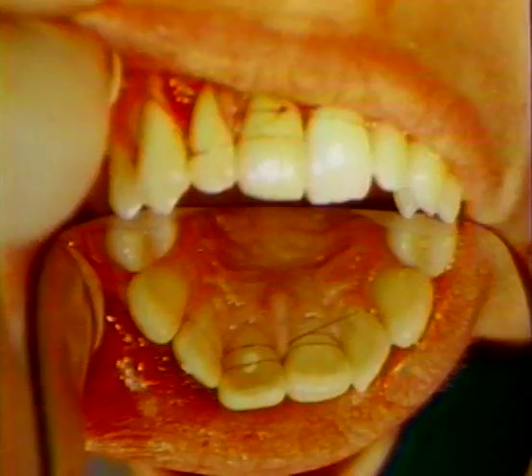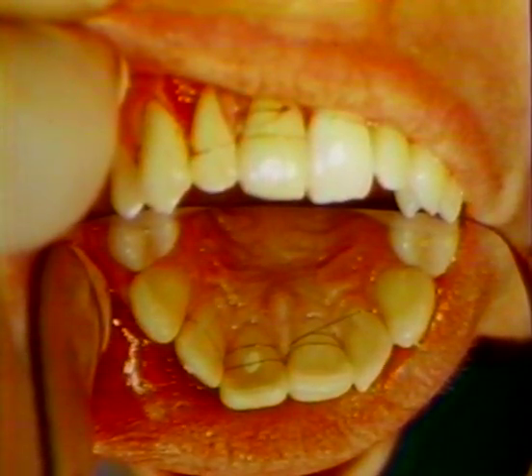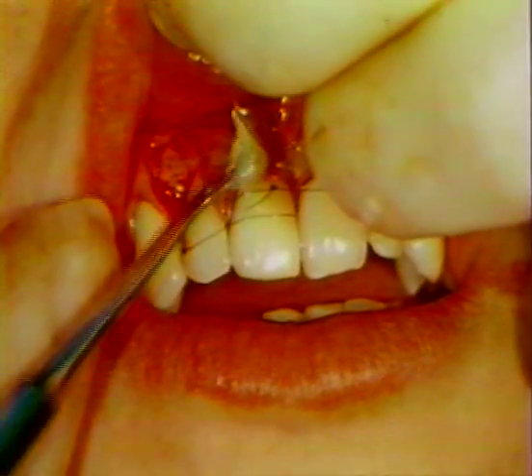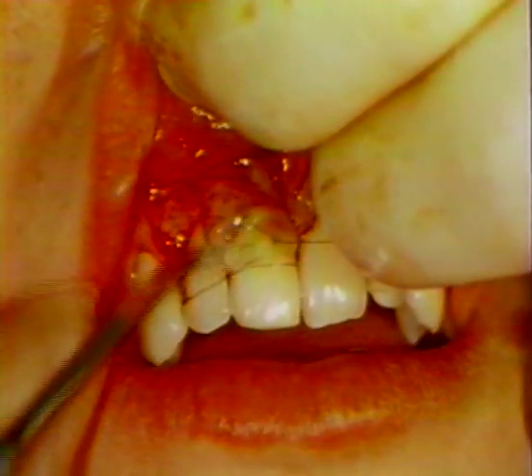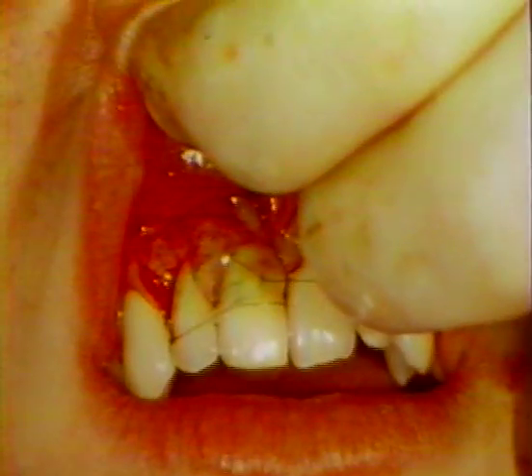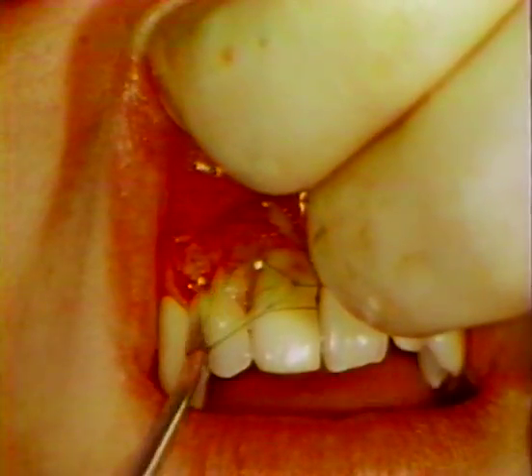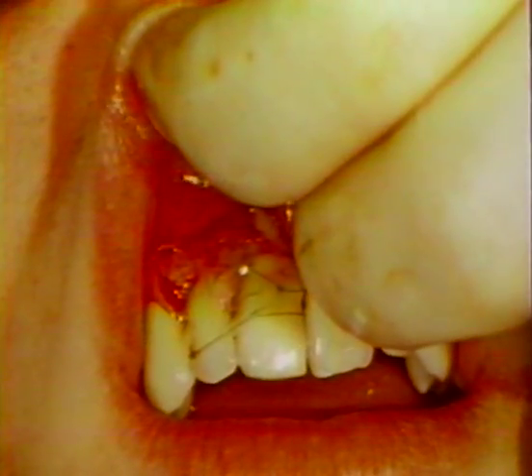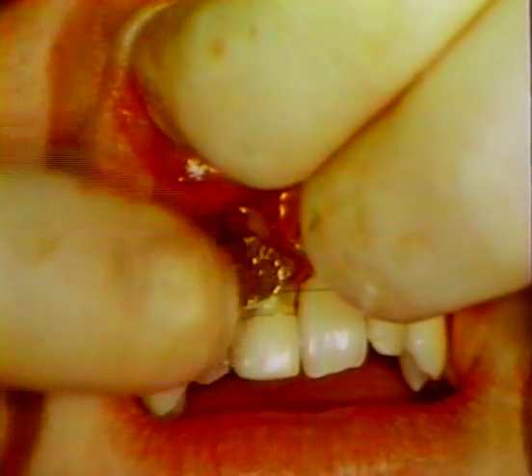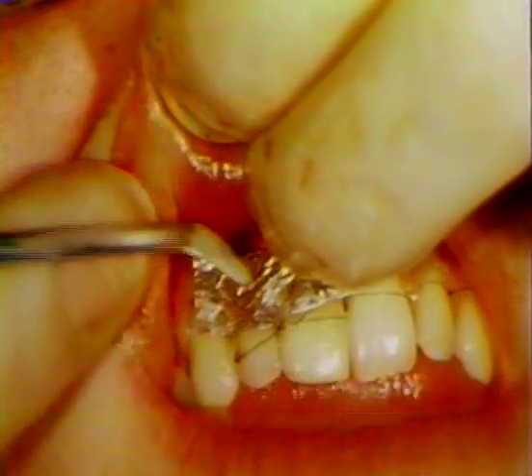The position of the sutures can be seen in this palatal view. Two and 1/2% Aureomycin ointment is placed over the denuded bone and sutures to lessen the chance of infection. Tinfoil is then placed over the area of the surgery and adapted to the teeth and soft tissues.